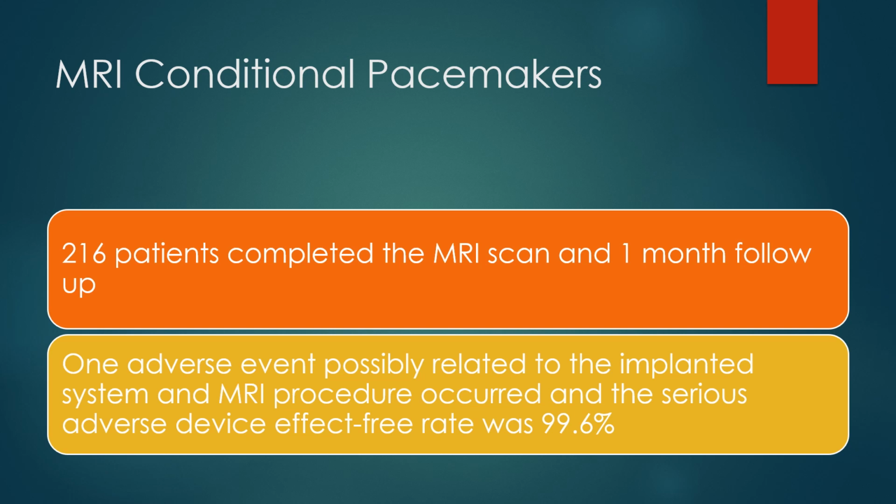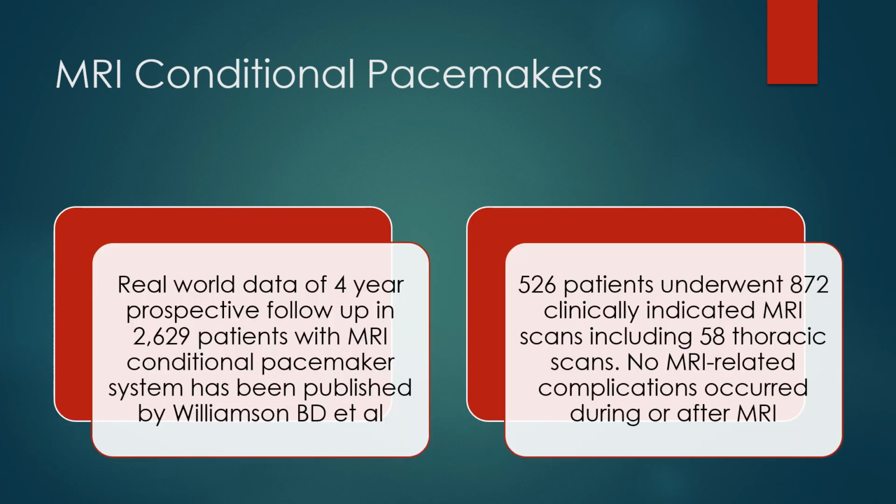One adverse event possibly related to the implanted system and MRI procedure occurred. The serious adverse device effect-free rate was 99.6%. Real-world data of 4-year prospective follow-up in 2,629 patients with MRI conditional pacemaker system has been published by Williamson and associates. 526 patients underwent 872 clinically indicated MRI scans, including 58 thoracic scans.